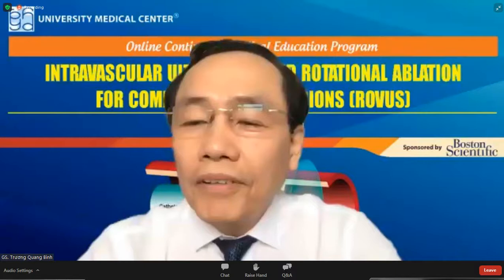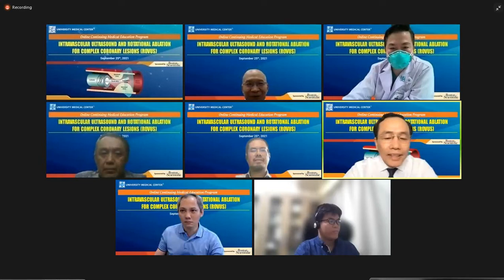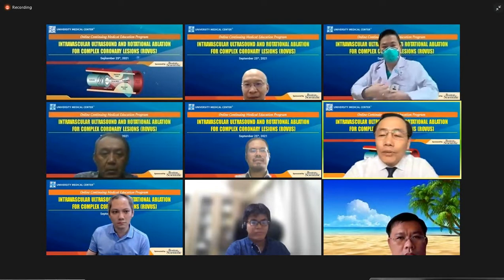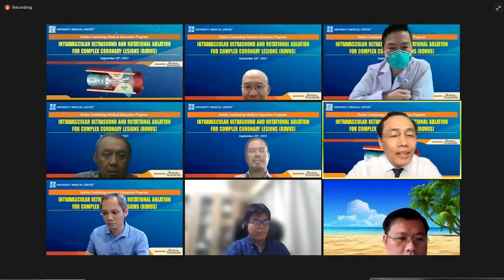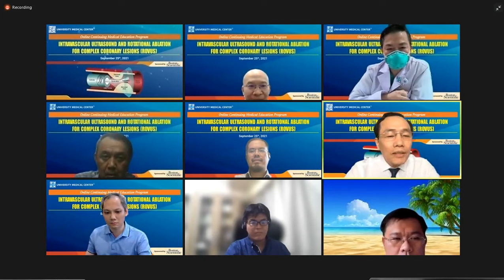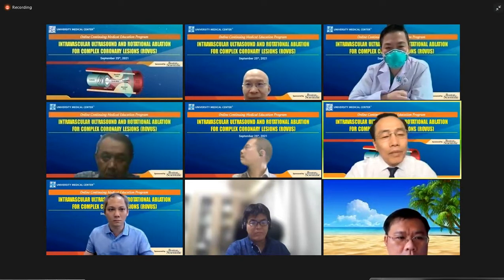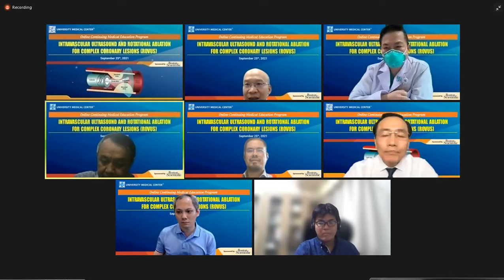Thank you Dr. Duy Phương. Now we have about 10 minutes for discussion about this case, and then we change to the live case because the live case is already ready. I want to listen to Dr. Nguyễn Thượng Nghĩa. Do you think that the way of Dr. Duy Phương for this case is the best way? Do you have some comment about this case, Dr. Nguyễn Thượng Nghĩa? Yes, thank you.